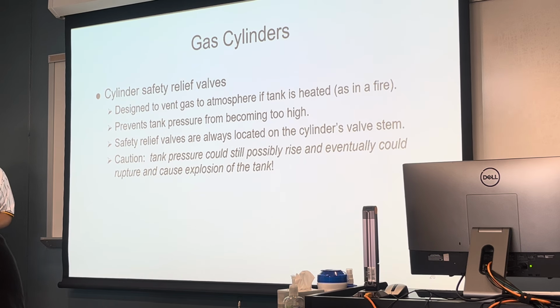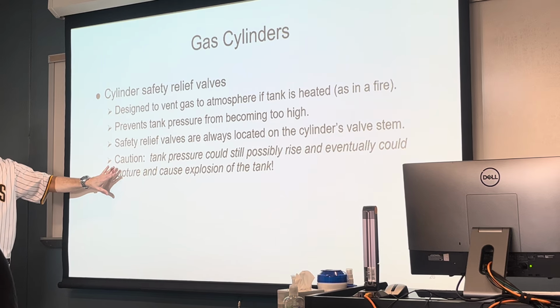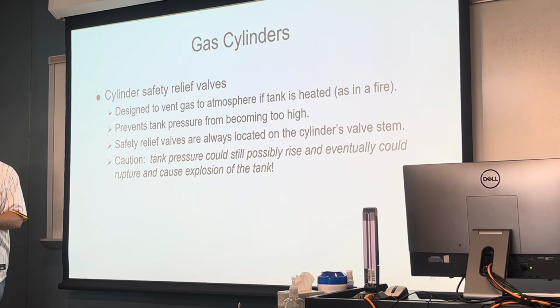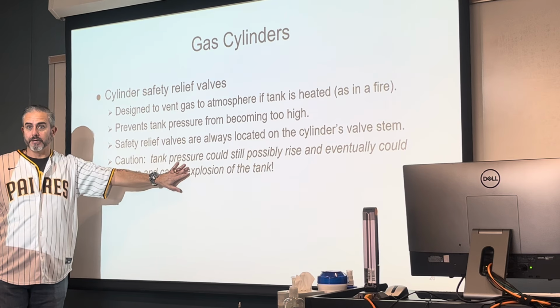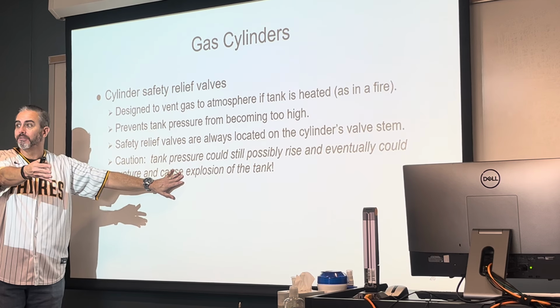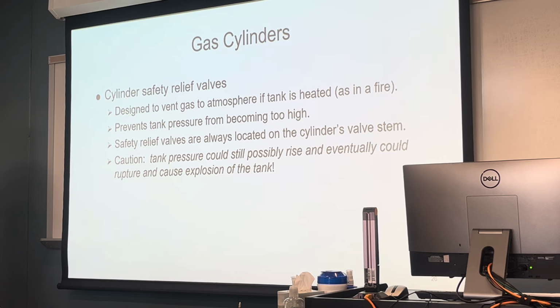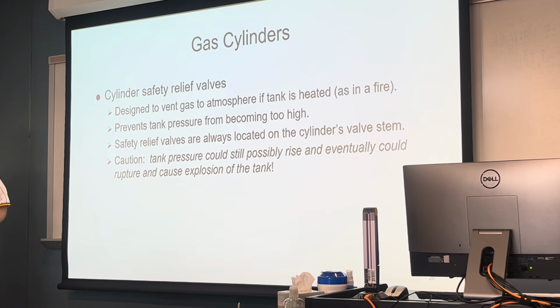But I will say, if the temperature gets too high, it might not allow enough gas to escape. Plus, if you think we're in a fire and there's an oxygen tank that's venting what gas? Oxygen, that's combustible, it still could explode. Okay, it still could explode. So, yeah, it's great that we have some sort of safety mechanisms here, but if there's a tank in the middle of a fire, I'm going to say, fire rescue's on the way. Okay, I'm going to go the other way and be protected before that tank was to explode or rupture.